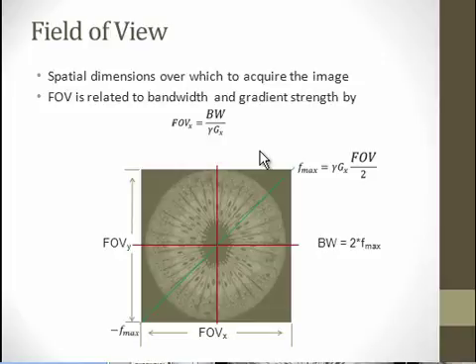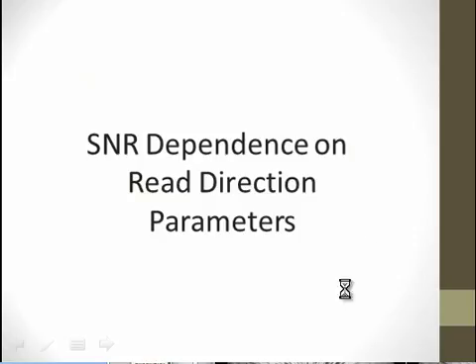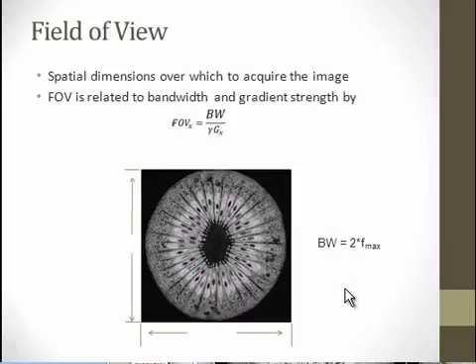So you're imaging small things like this kiwi fruit. You really need high performance gradients, and this image was acquired in a 7 Tesla research magnet, and most of these research machines have very strong gradients. So you might be able to get something like this on a clinical machine, but it may not look as nice. The spatial resolution will probably be less, and we'll talk about spatial resolution soon.